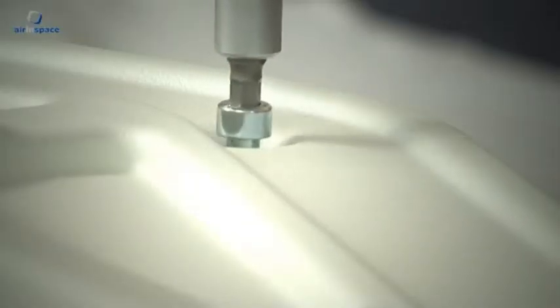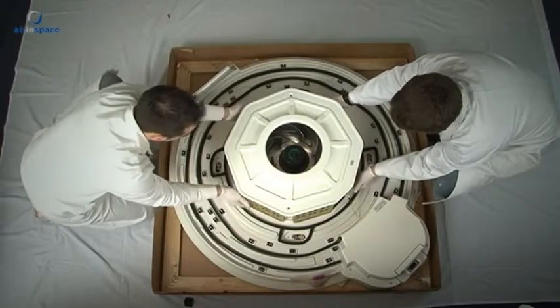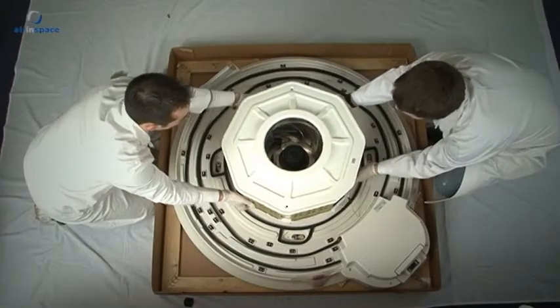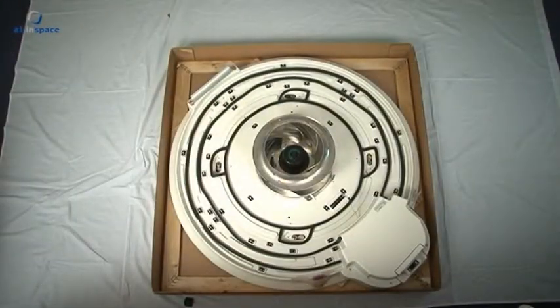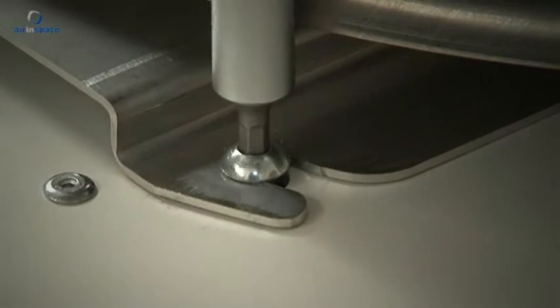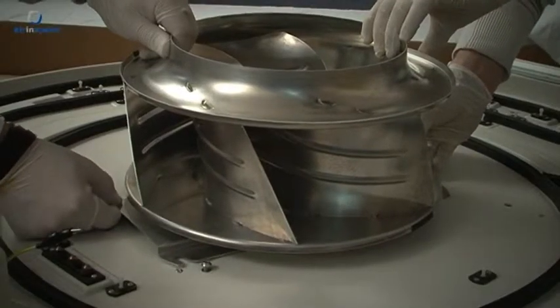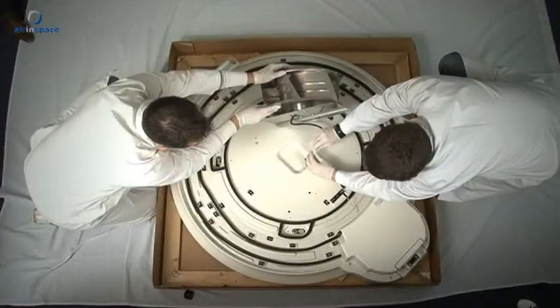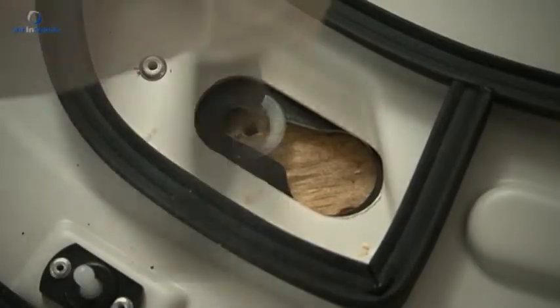Use the 6mm hexagonal allen key to undo the final reactor module. Use a Phillips screwdriver to unscrew the base from the casing.